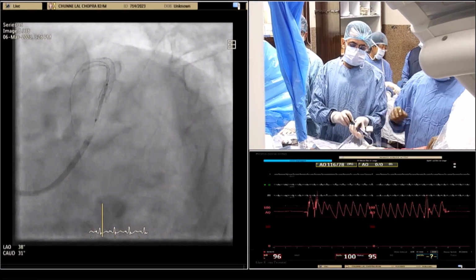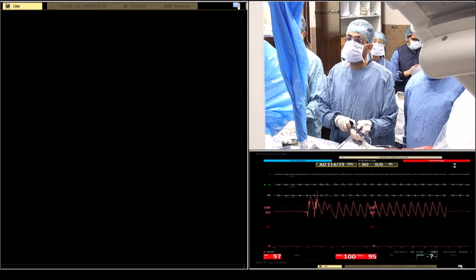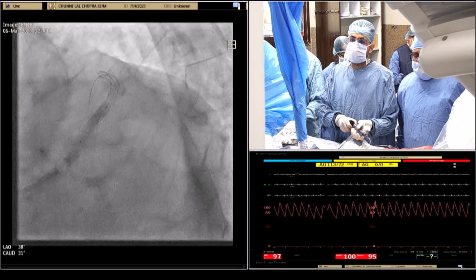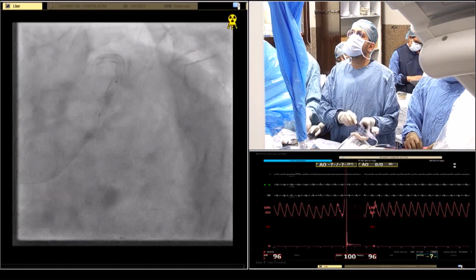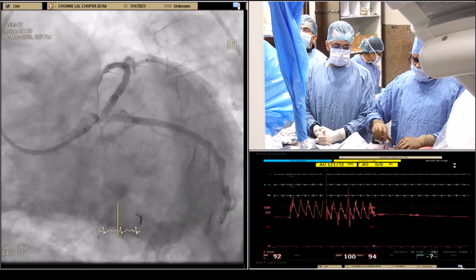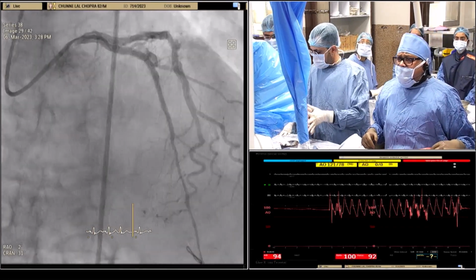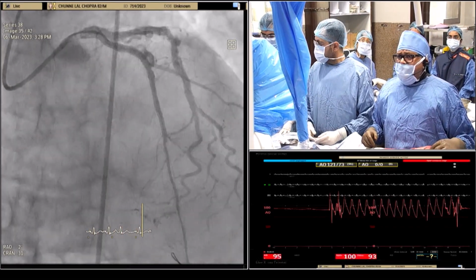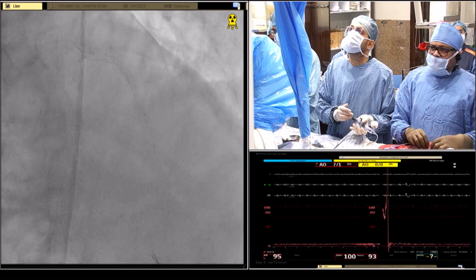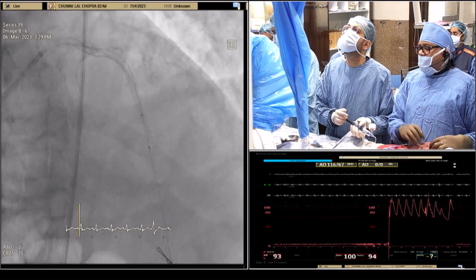Stop. Negative. Inflate. 8, 10, 11, 12, negative. So this is what, and then now epicardial. This is what we have achieved after putting the stent across. Let me post dilate it. 3 millimeter NC. See, one good thing is the diagonal is flowing well. So we are going to dilate the distal LAD stented segment with the 3 millimeter NC. Can you have a stent boost please?